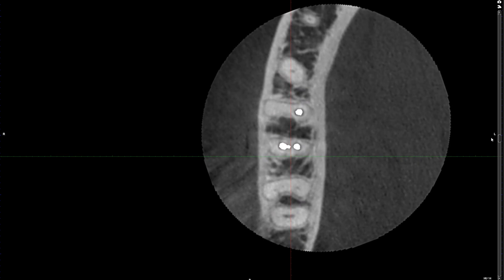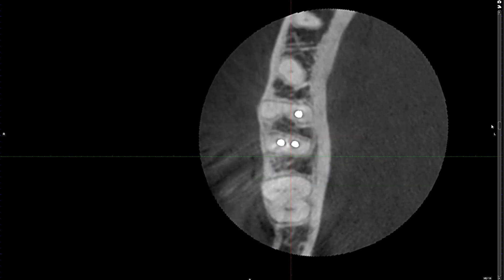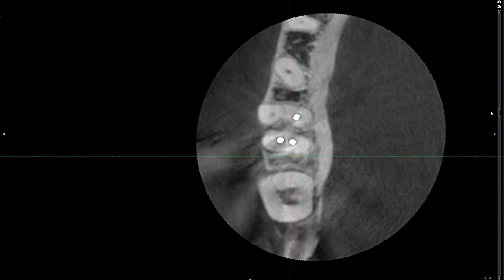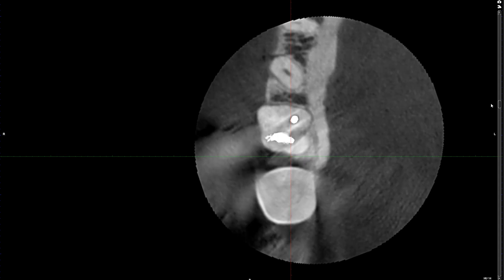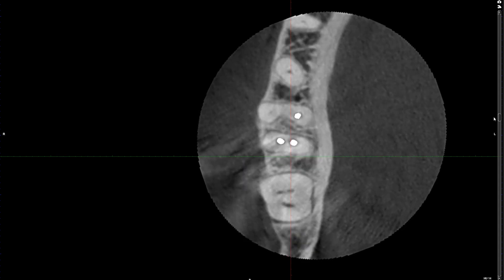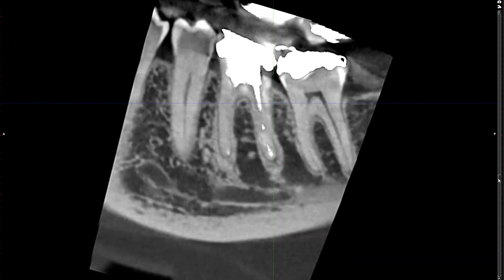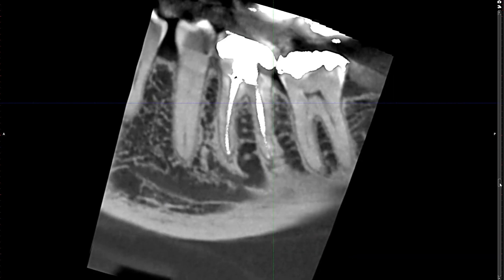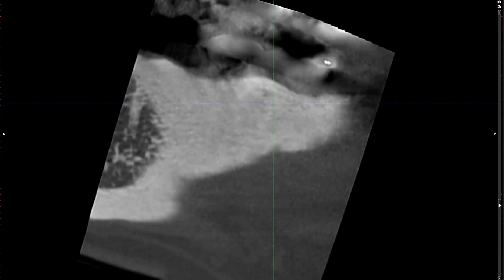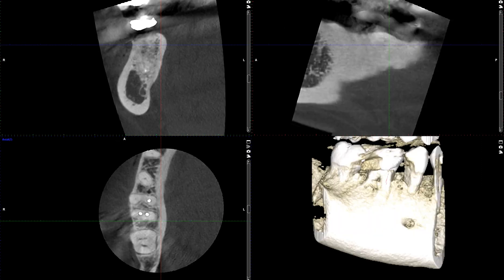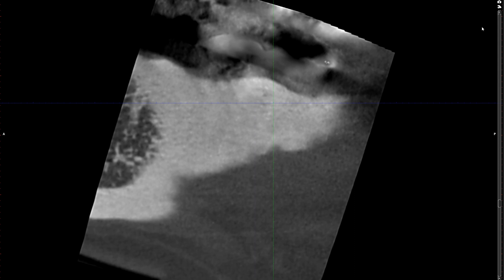Do you see any issue — a glaring issue — in this patient's case? If you don't see it, I'd like to show you one more view. Let's take a look at the sagittal view.